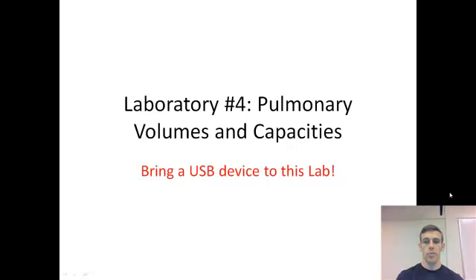Okay, so this is laboratory number 4, pulmonary volumes and capacities, and I have a little note here in red. Please bring a USB device to this lab. You're going to need a USB device to pull off the information from the computers that we have here. We're going to be using the new BioPack systems.